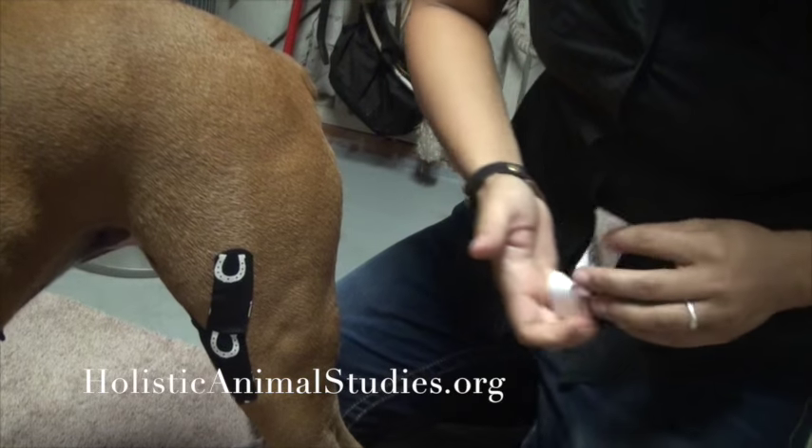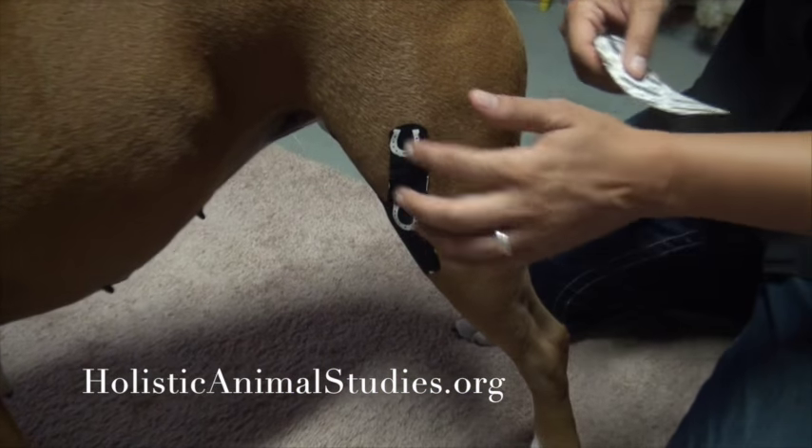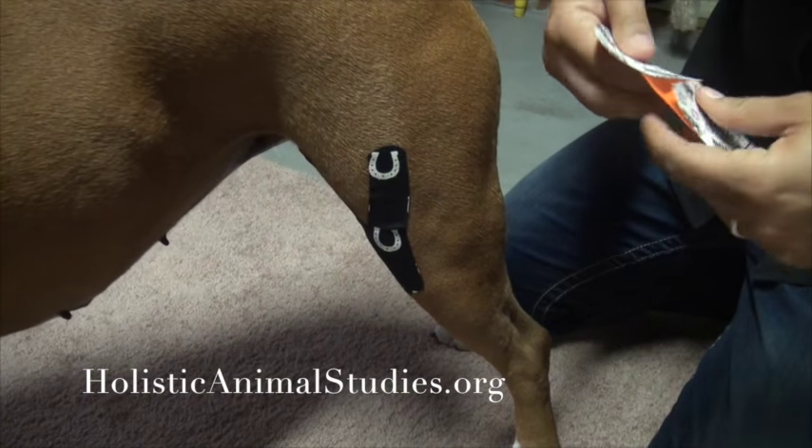You can actually do this either way — you can either lay the stabilization first and then put the Y, or you can do it this way and then do the I strip as the stabilization on top of it. So that's what I'm going to do right now.